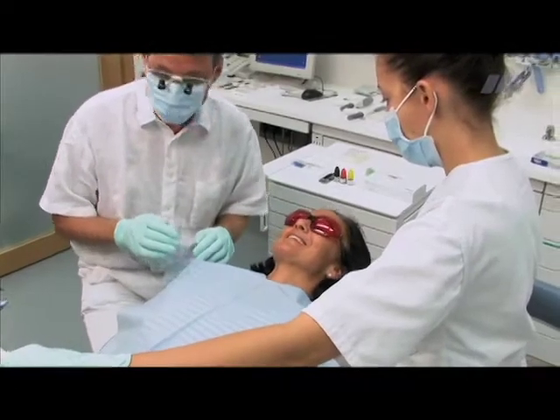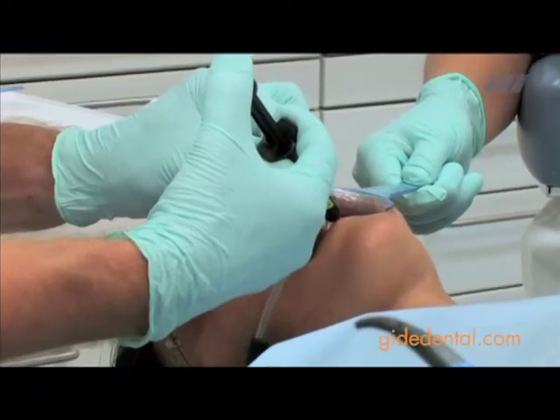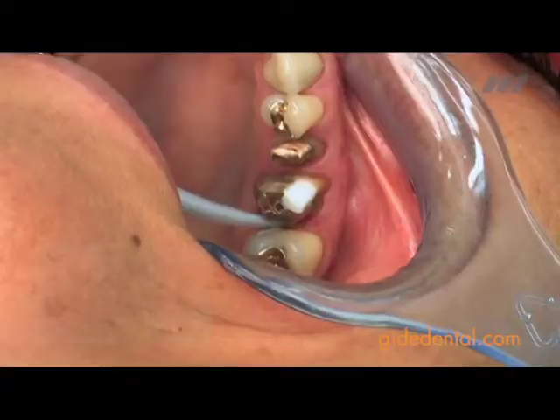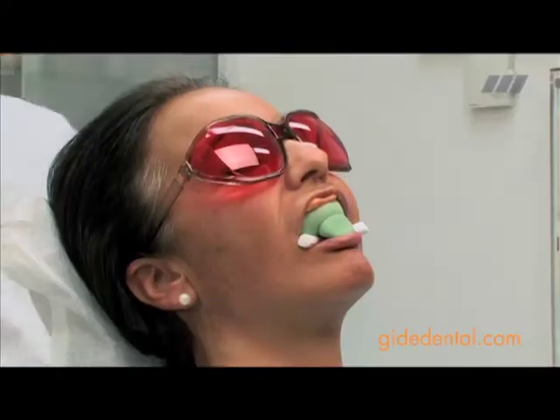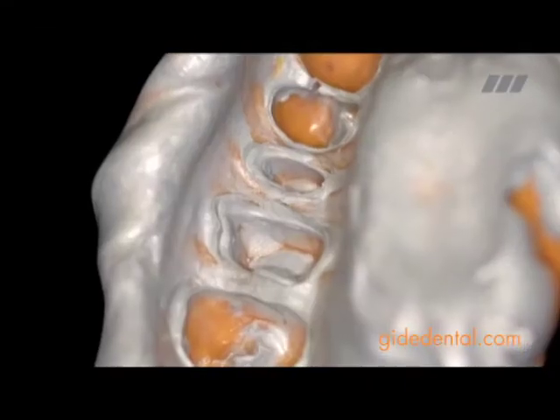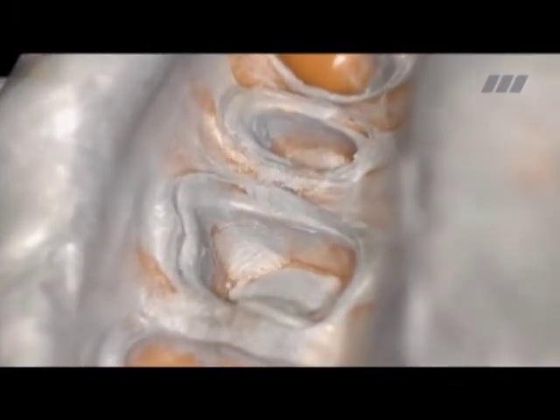Both defective metal ceramic crowns on the devitalized teeth 2-5 and 2-6 have to be replaced. Inspection shows that the subgingival preparation margins are precisely recorded, and the procedures in the laboratory can be carried out based on a perfect impression.